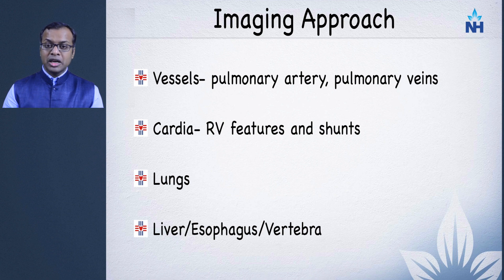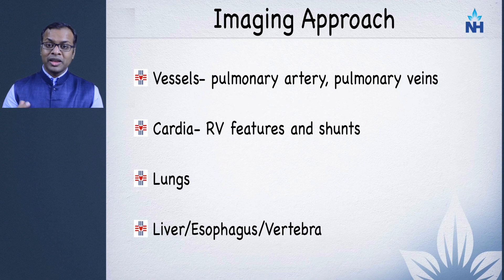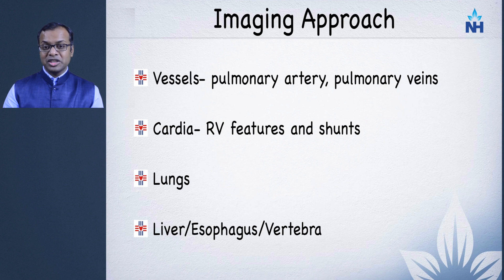Then look at the lungs: look for emphysema, interstitial lung disease, and any pathology that can explain hypoxia. Check the liver because cirrhosis can also cause pulmonary hypertension. Look around the esophagus for venous collaterals or portosystemic shunts. Also examine the vertebrae for extramedullary hematopoiesis, seen in thalassemia or sickle cell disease, which can also cause pulmonary hypertension.